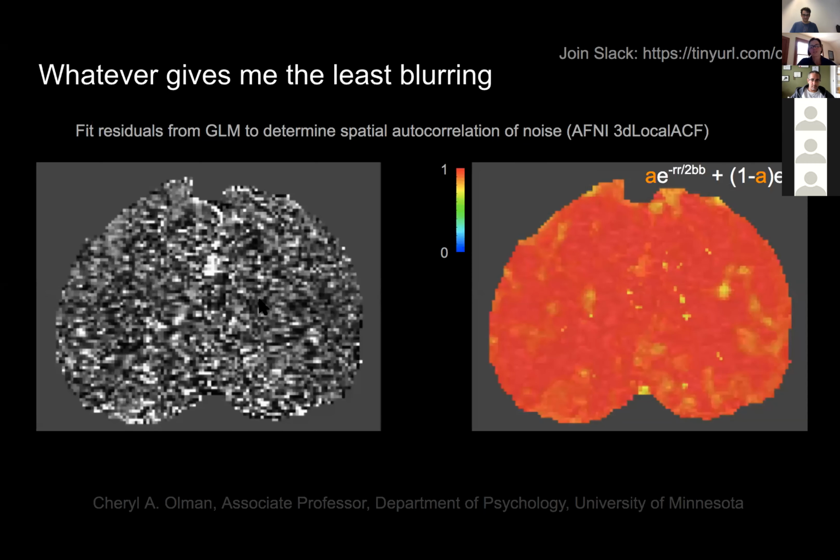The way I've been characterizing my image resolution is to use AFNI's functions for estimating the structure of the spatial autocorrelations in my residual noise in my functional experiment. If you look at the residuals after you run your GLM, you've detrended and demeaned your data, and you've hopefully stripped out the correlations that are introduced by your stimulus response.